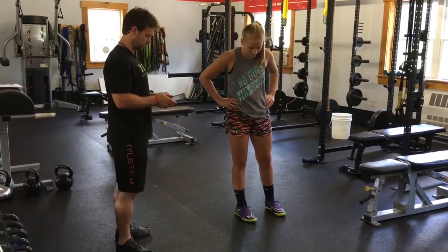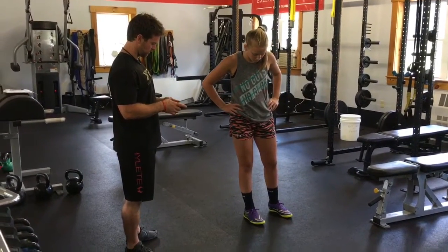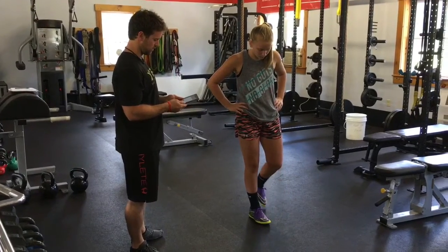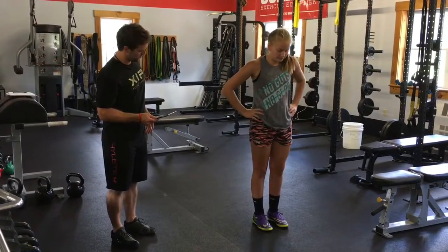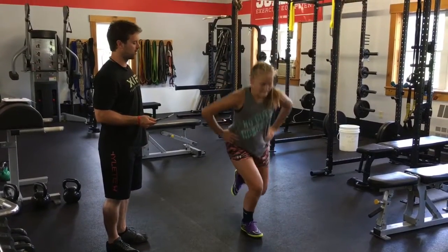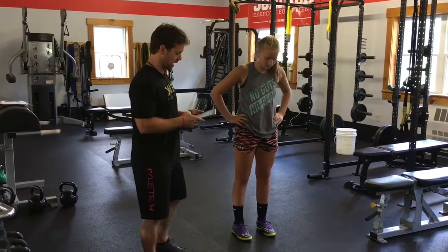So Lindsay, we're going to start with your right leg. She's going to do two jumps. Go ahead. Drive. Good. Relax. And one more — dip, drive, everything you've got, let's go, get up. Good. Relax. Right side's in.